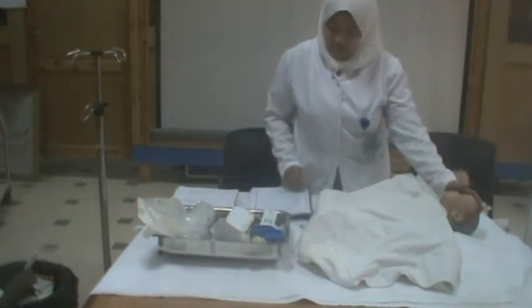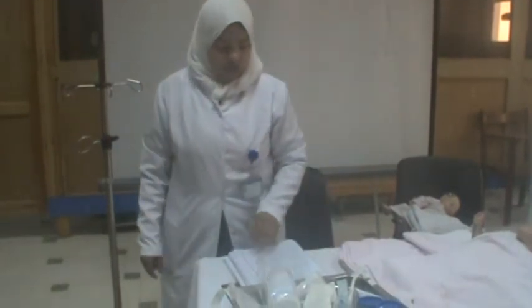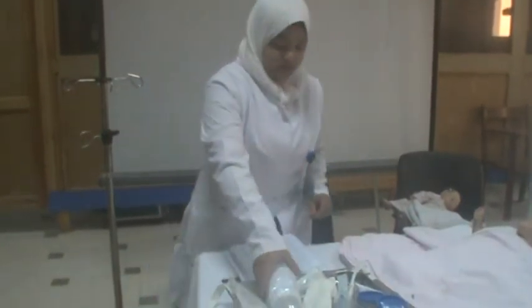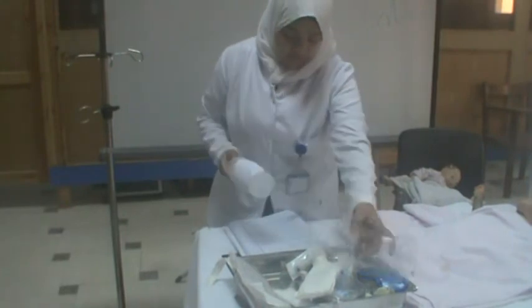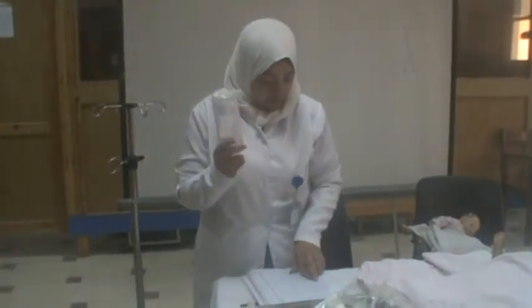Establish cooperation of the child and parent. Wash hands with soap and running water. Prepare all needed equipment. Set up the intravenous infusion in an area not visible to the child. Inspect the solution for any abnormalities and check the expiry date.